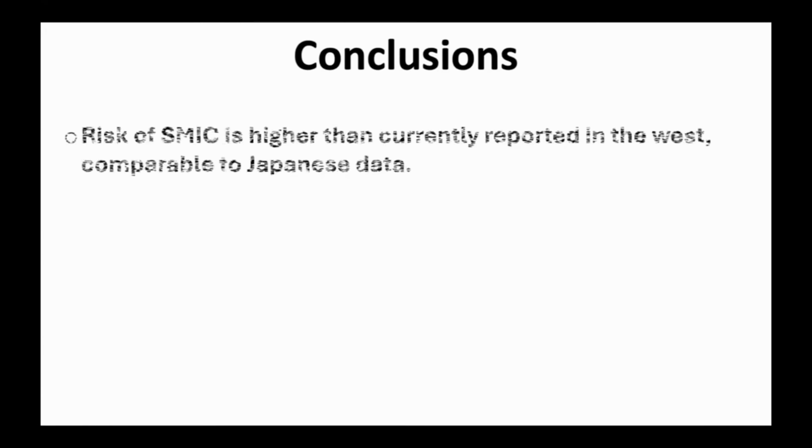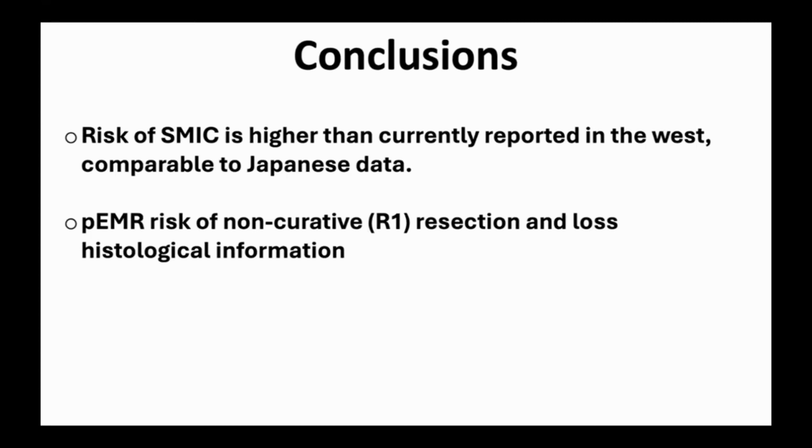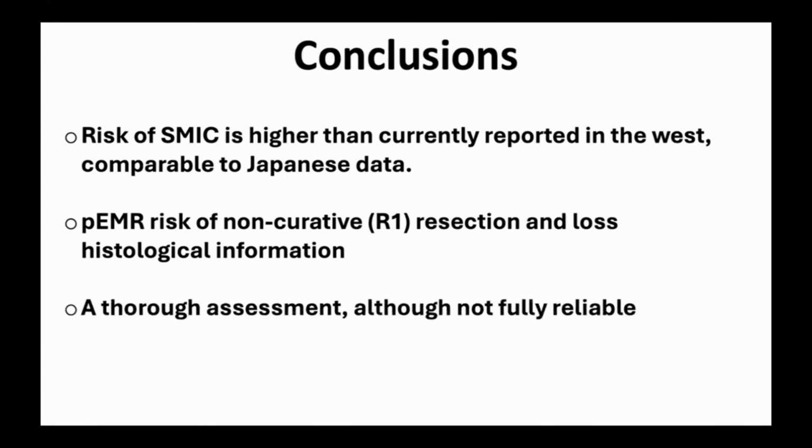This is important because my whole talk is about lesion characterization. The fact is that the risk of deep submucosal invasion is higher than currently reported in the West, and what we found from our multicenter studies is comparable to Japanese data. So the piecemeal EMR risk of non-curative resection and loss of histological information seems to be much higher than what we think. A thorough assessment is important, but cannot be fully reliable.